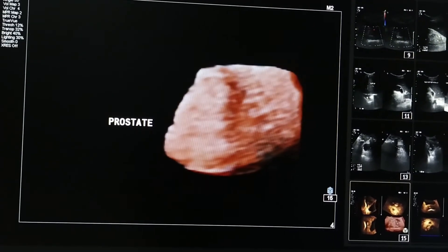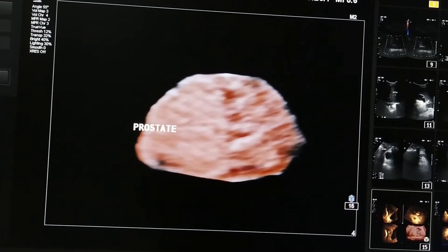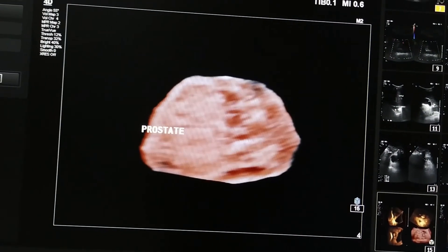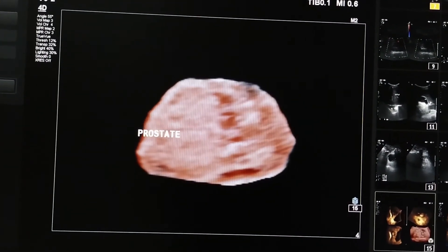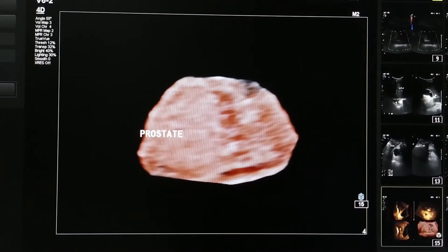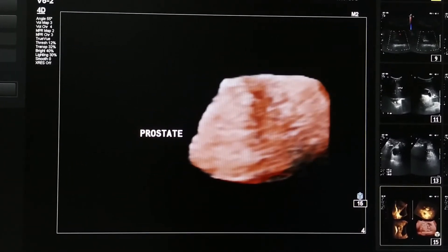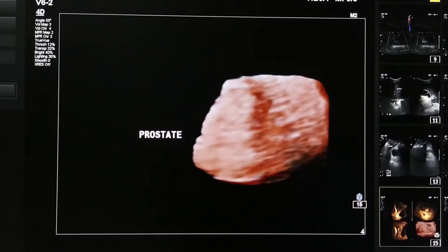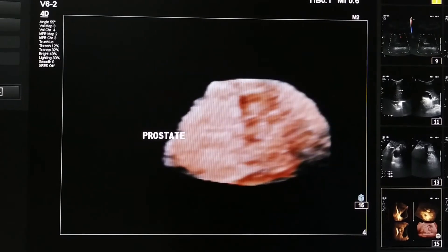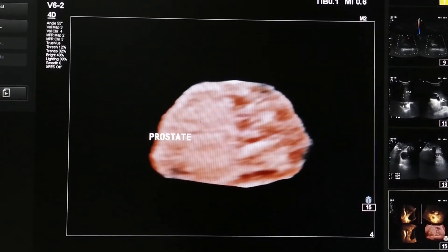Now I can see the prostate rotating in different angles. So, 3D ultrasound can be used to evaluate solid organs and see the lesion from different angles.